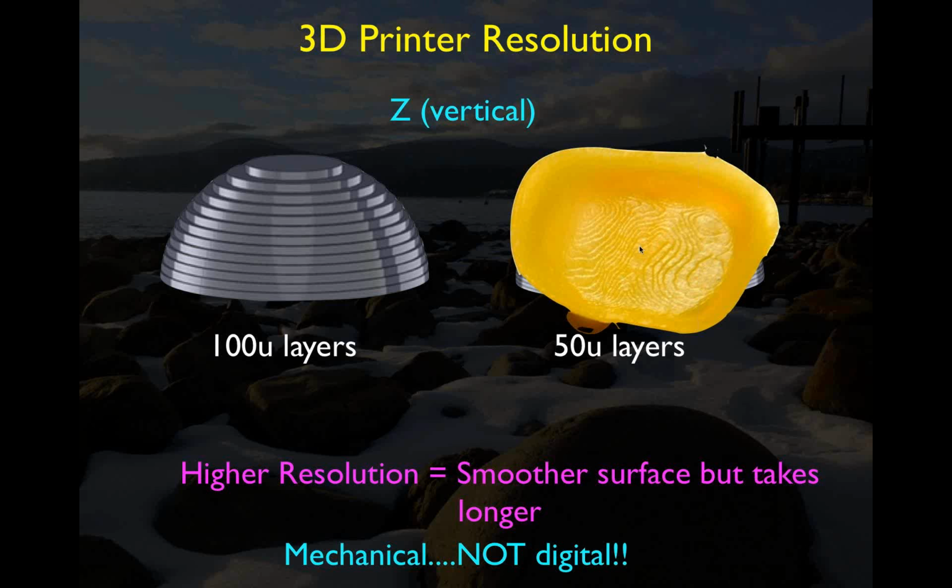So as you decrease resolution or go to thicker and thicker layers, these stair steps become bigger. In a case like this, we want as close to the finest resolution we can get to try to eliminate this. And I will say this, that early on when we did some castings, you will see this in the castings. And we had to have some conversations with some dentists about the fact that this wasn't bad, this was the nature of it. And in fact, if you really want to get to it, maybe it helps increase cement retention.